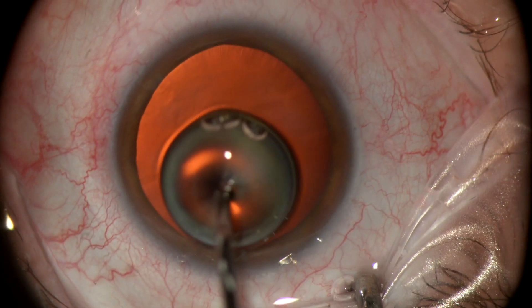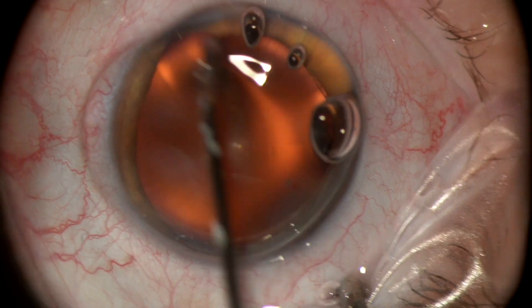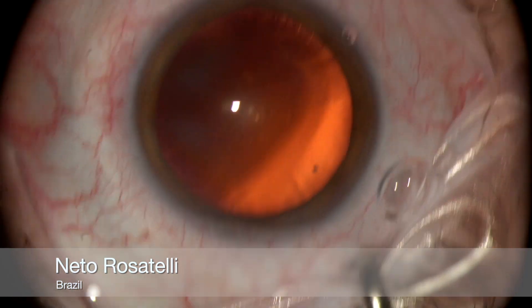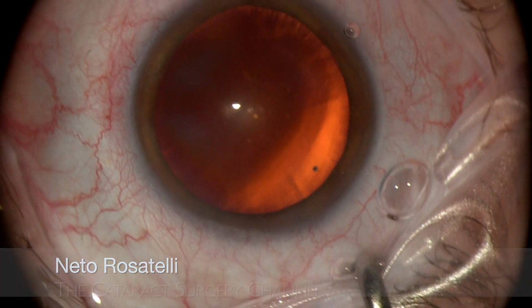I like to cover the cornea with dispersive OVD because visualization is greatly enhanced and the cornea remains protected and wet throughout the surgery.